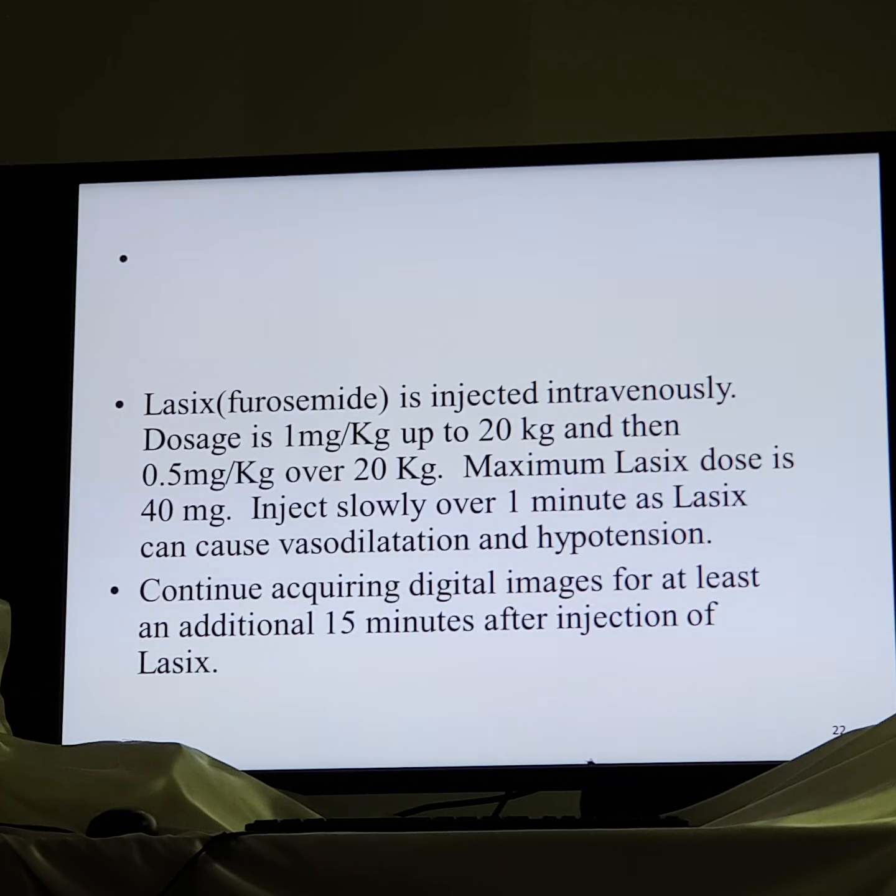If we're not using the Lasix, we will scan the patients 1 hour to 3 hours later, depending on the initial image. If the filtration is good and the patients reach the peak and filter within the time, there is no need to scan the patients 3 hours or 1 hour later. If there is still collecting or the kidney has not cleared the activity, we should scan the patients after 1 hour. If we are using Lasix or any diuretic agent, we don't need the delayed scan.